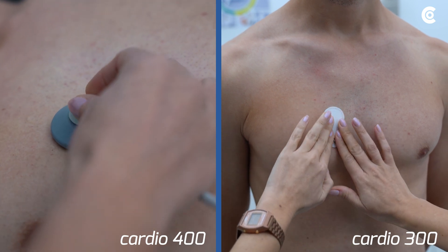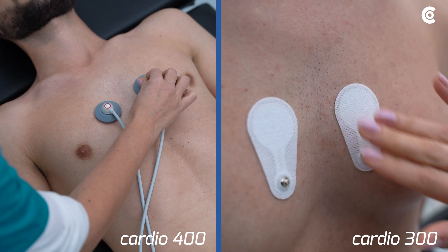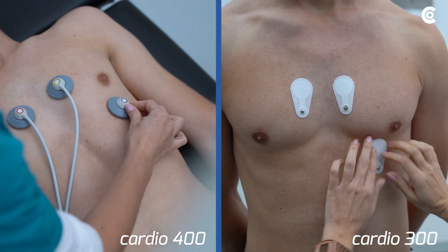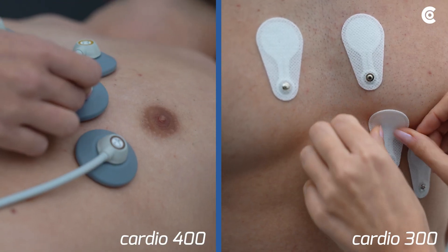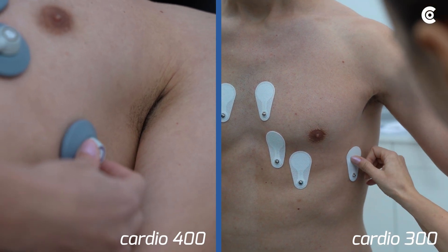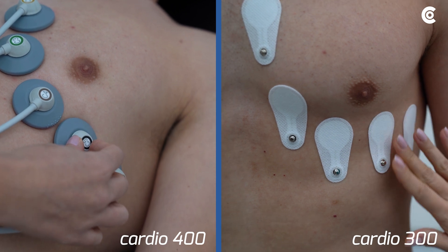C1 in the 4th intercostal space at the right sternal border. C2 in the 4th intercostal space at the left sternal border. C4 in the 5th intercostal space on the left mid-clavicular line. C3 left on the 5th rib between C2 and C4. C6 left on the mid-axillary line at the same height as C4. And C5 left on the anterior axillary line, also at the level of C4.